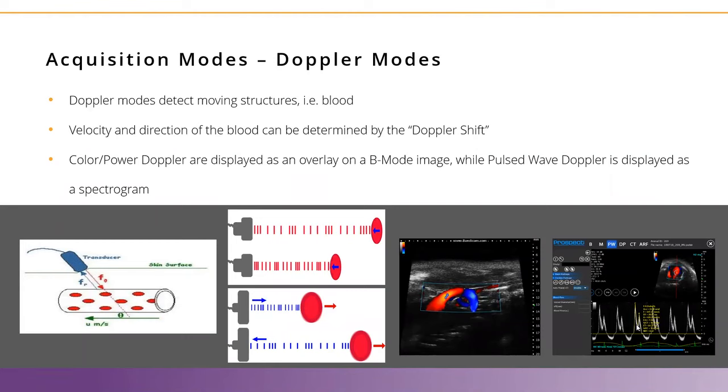And we'll talk more about this when we look at specific images of cardiovascular function. But for those of you who do this work routinely in your lab, you'll recognize this right away with the full measurement package to assess diastolic function.